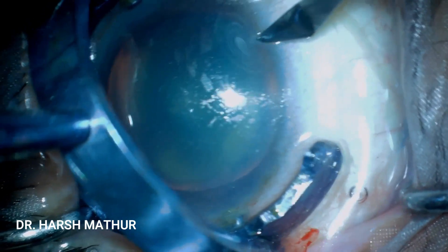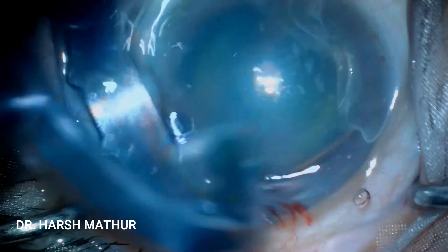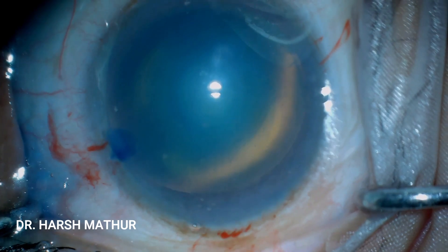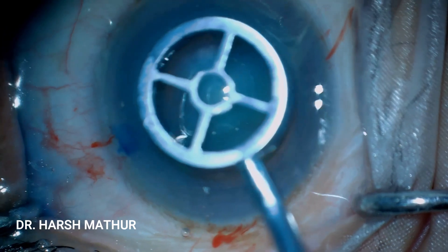As the surgery is being done under topical anesthesia, at times the patient might give a jerky movement, for which the surgeon needs to be ready.